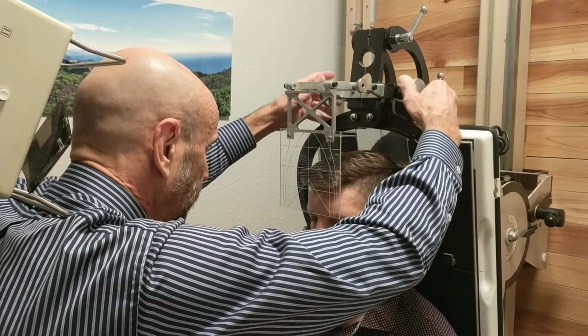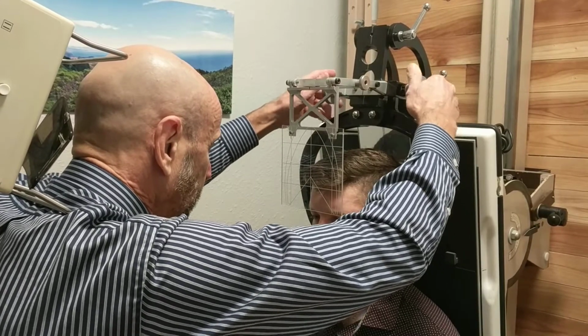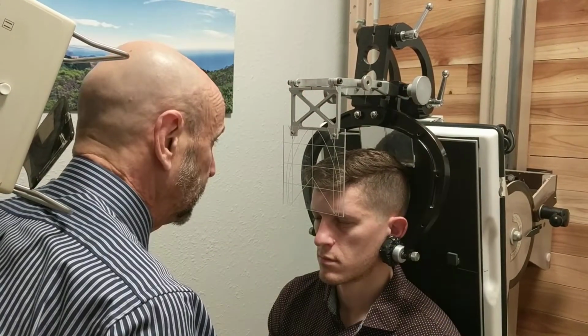And so as I'm bringing in the head clamps, I'm making sure that I'm not moving the head as I bring them in. And this looks good.